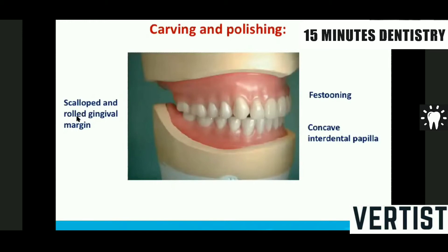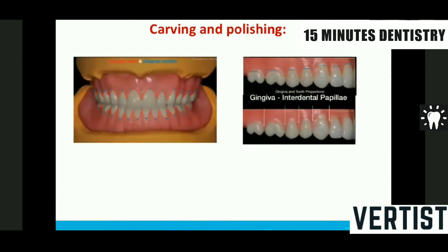Now we have scalloped and rolled-in margins of the gingiva, and we have the cuspid eminence — you can see a thick cuspid eminence here. We should do good festooning, meaning scalloping, and the interdental papilla should be concave — it should go inside with no bulk. From the canine to the second premolar there is a gradual lowering of the gingival margin.